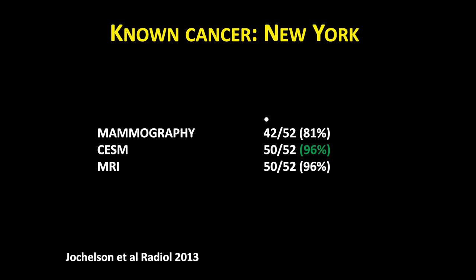We did the first bilateral contrast mammograms in 2010 and demonstrated, to begin with, that we could easily do bilateral contrast mammography after only 1 injection. We also demonstrated in a population of women with known breast cancers that contrast mammo was similar in sensitivity to MRI, and both significantly better than mammography alone.